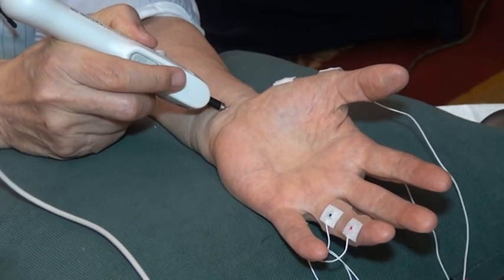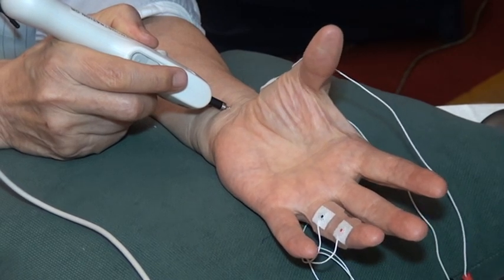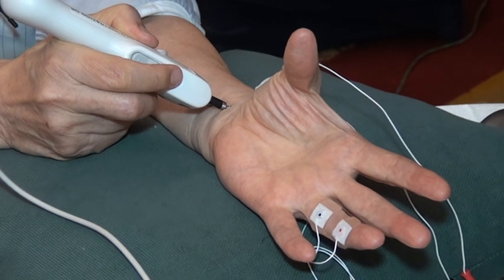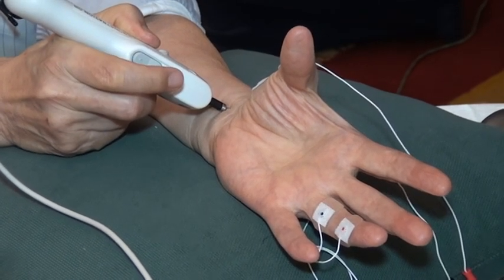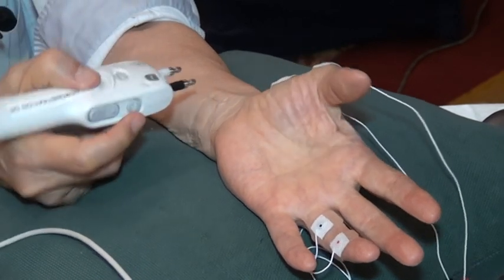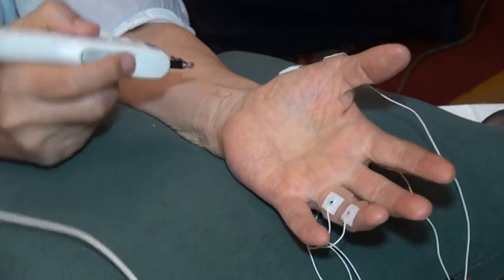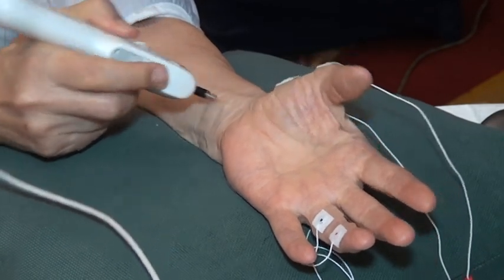Now, I'm going to move my thumb up a little, like this. You see that? I just moved up, but I'm at rest, and I'm going to stimulate again. See what happened? What happened there? Let me do it again, the second one.